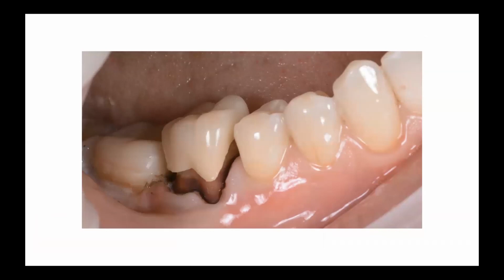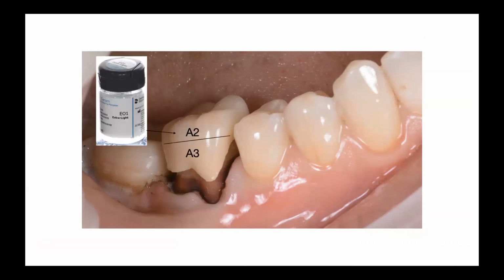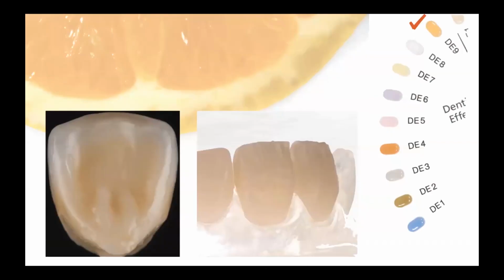But like working according to the cutback technique, there is one more approach. For example, I used this approach when I made the single crowns. There, different dentin was applied. So in the area of enamel, I applied the lighter dentins, and after that I used more translucent, opalescent enamel. And that crown was rather nice in the patient's mouth.